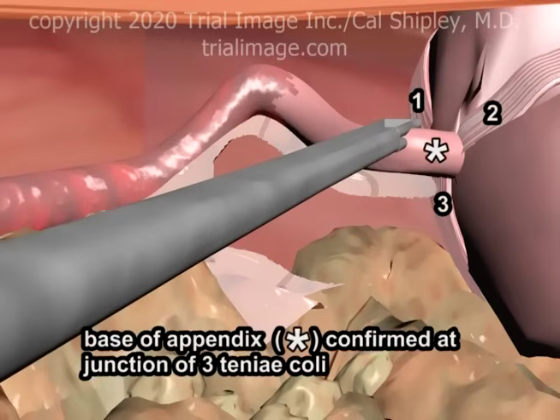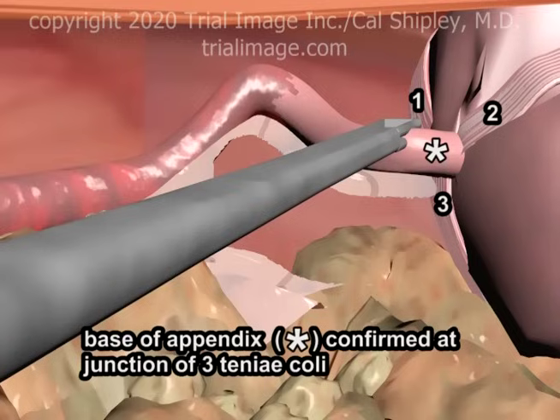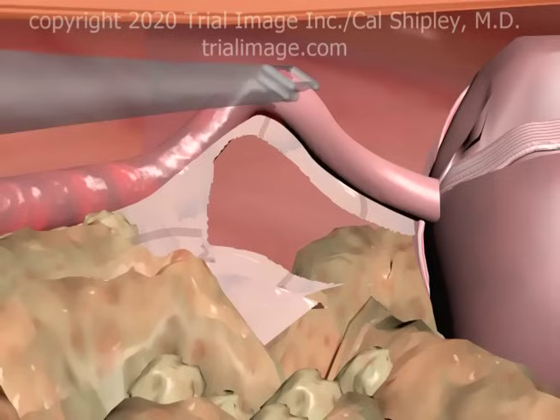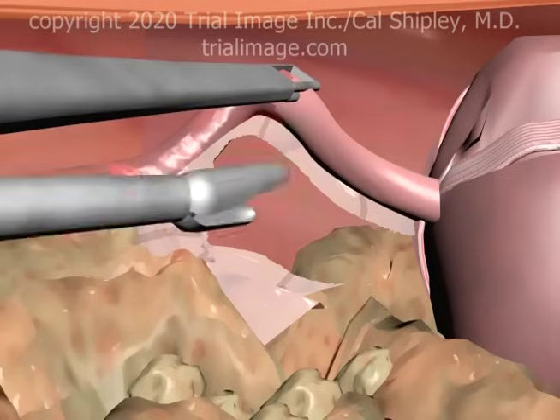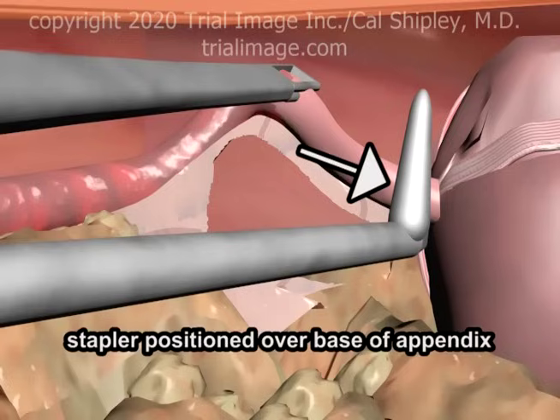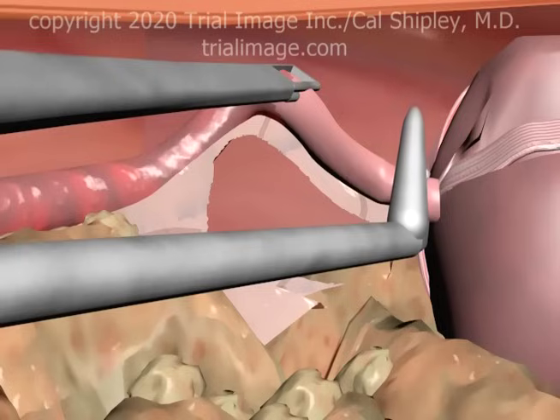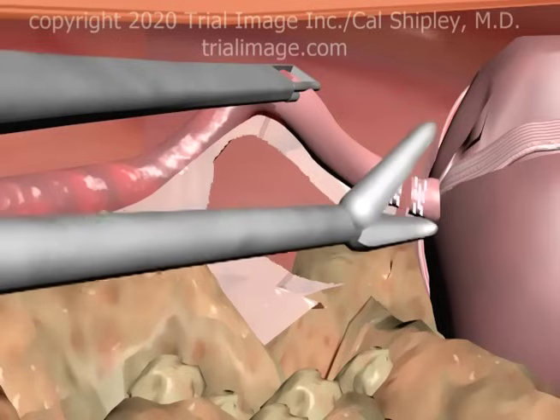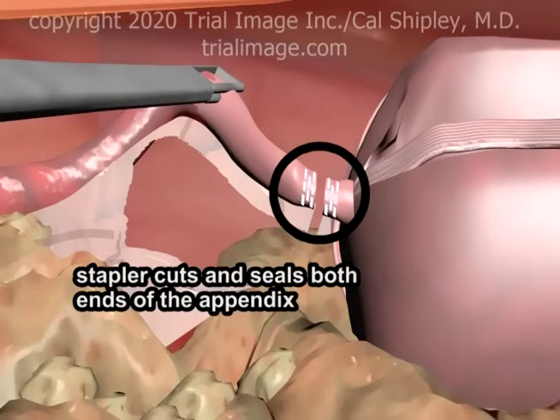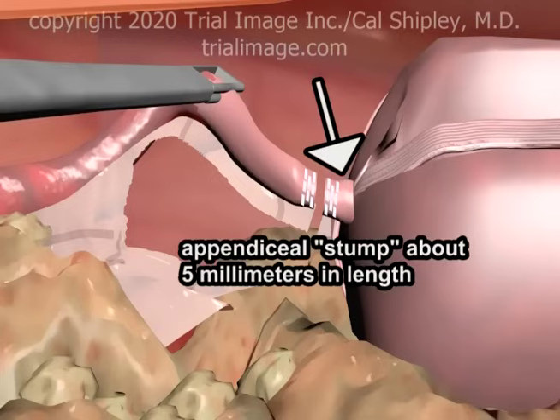Once the blood supply has been separated, the surgeon confirms the location of the appendiceal base, using the junction of the three teniae coli as an anatomical landmark. A surgical stapler is positioned over the appendiceal base, and with one action, it severs the base from the cecum and also staples and seals both sides of the incision. The remaining appendiceal stump is about five millimeters in length.